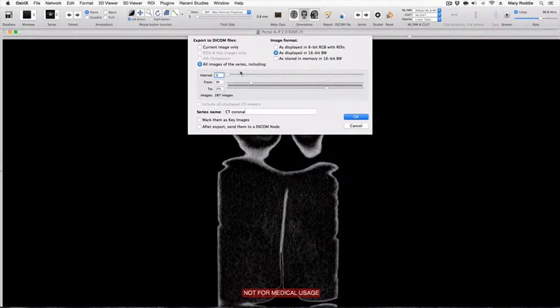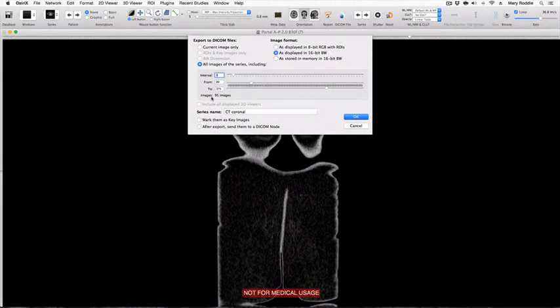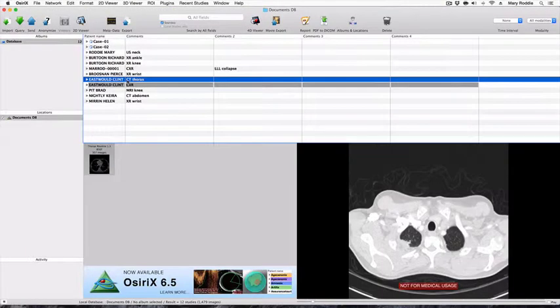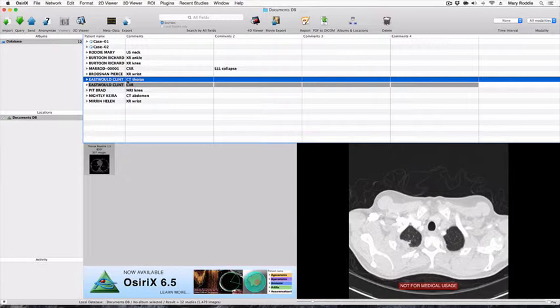To reduce the image number still further we can increase the interval, and by going to an interval of 1 in 3 the series size is 95 images which is a good number for teaching. The final topic I would like to revise with you in this tutorial is the formation of MIP reconstructions or maximum intensity projection.